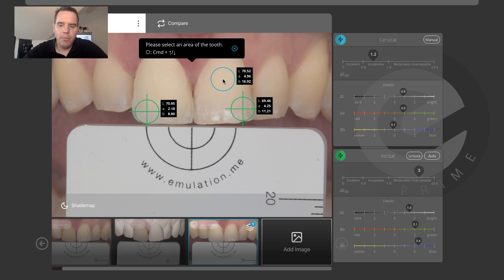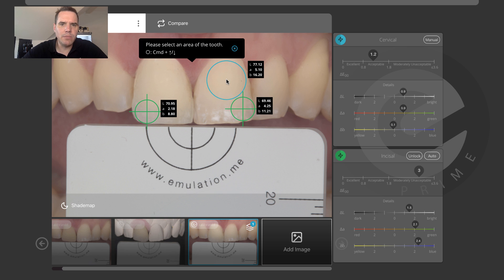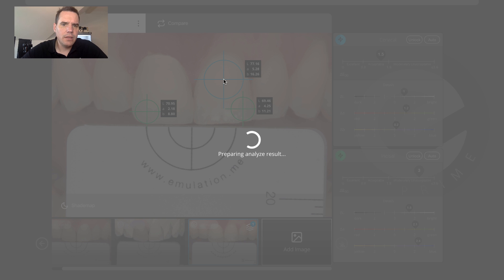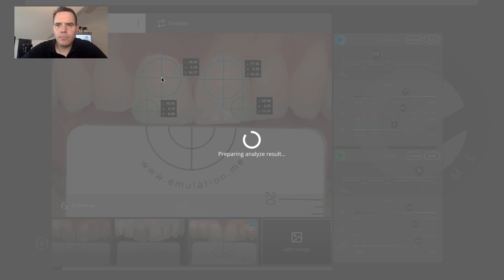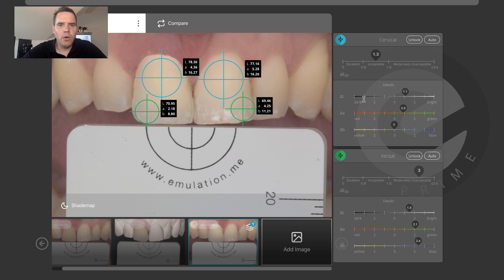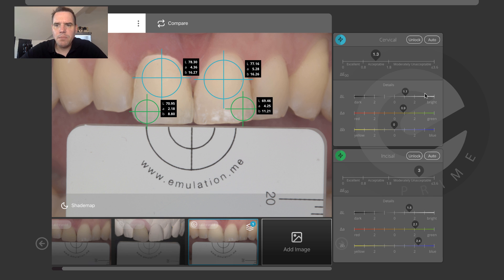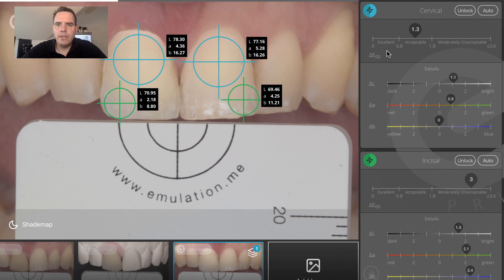You could also measure the color difference manually in the surface area. When you do that, make sure that your measurement area is large enough. You click on the tooth first and then you click on the crown, and then there's only a very small difference between both measurements. As far as these panels are concerned, this tells us what the color difference is and expresses these values in what we call the delta E. The delta E expresses the color difference between two objects numerically.